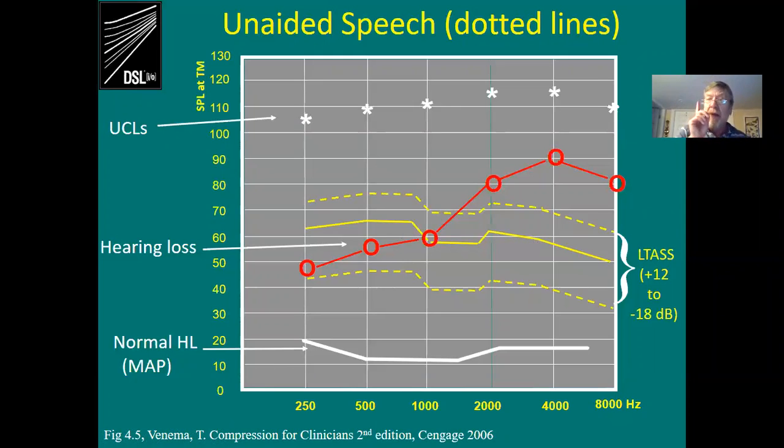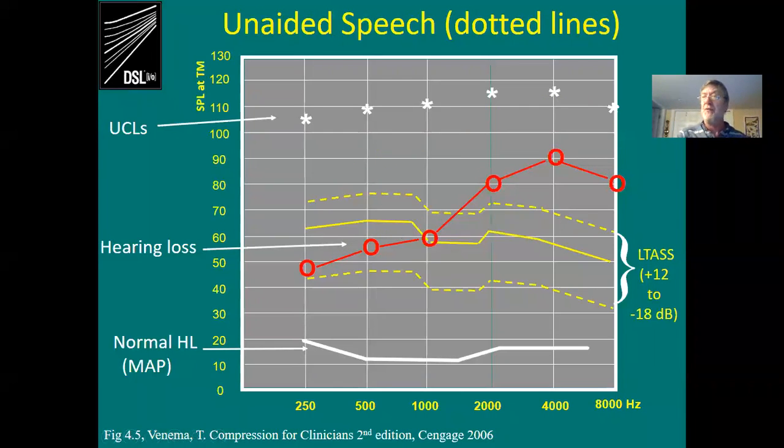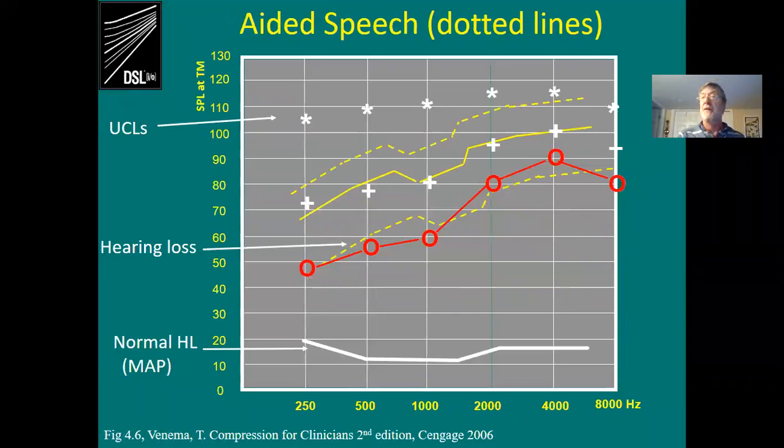Okay. When I'm aided with hearing aids, we're lifting that up where it belongs. You're comparing aided speech versus unaided speech. And you can counsel the client and show the benefit of the hearing aid visually and literally because you are mapping speech onto his dynamic range. And that's what today's Real Ear does, speech mapping.